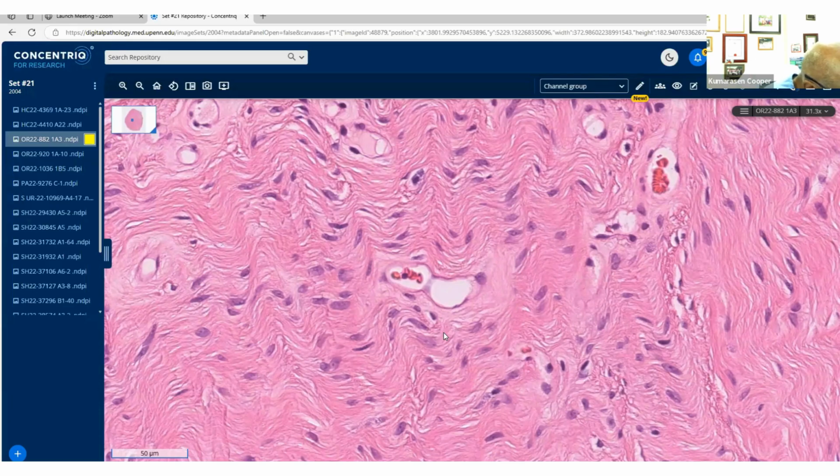It's just a neat little three spindle cell tumors, which, like I say, inadvertently fell in line with each other. And so it's a good discussion of these bland spindle cell tumors, which if you have good morphology, you can make them out. But the only thing you can really be sure of is a classic schwannoma, perhaps a classic neurofibroma. And there are some other things that you can be.